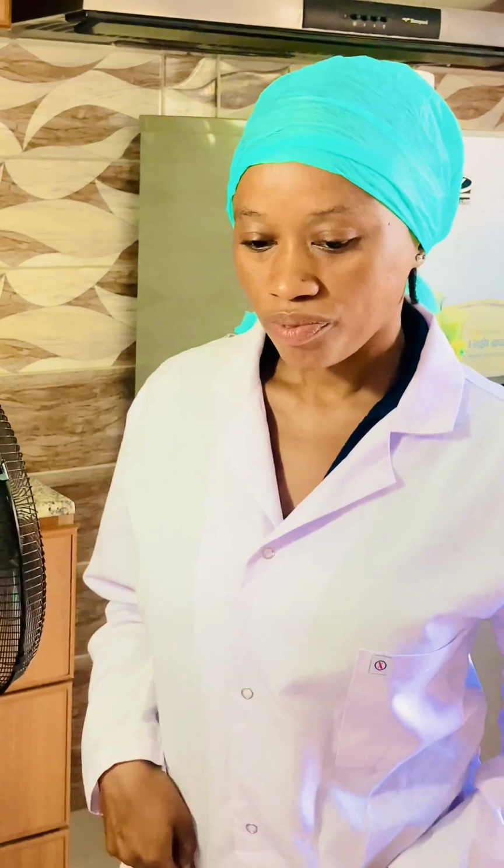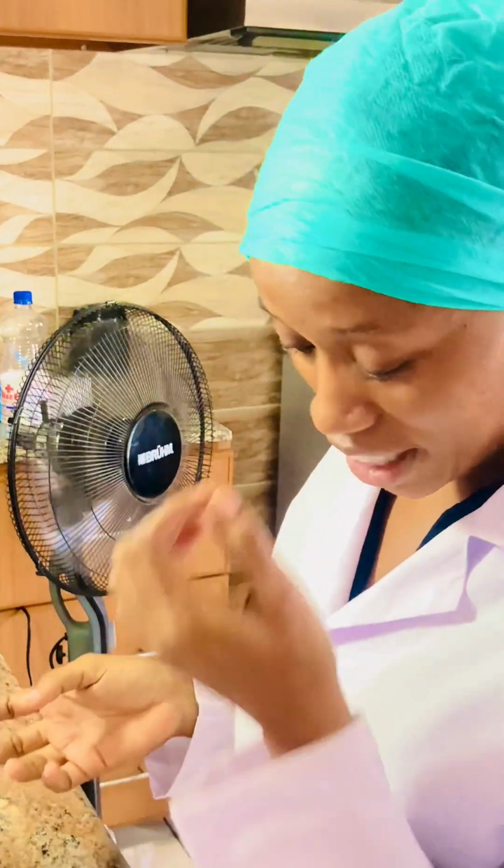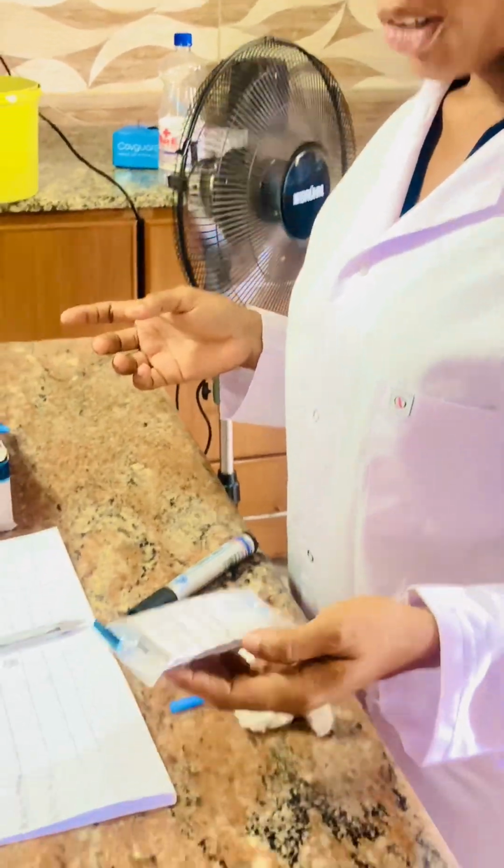Today our topic is how to do a malaria rapid test, normally called RDT. Today I will be explaining about malaria and doing some practicals on how to go about doing the malaria rapid test. Before going further, what is malaria? Malaria is a disease caused by a parasite transferred from one person to another by an infected Anopheles mosquito. And I'll be doing the practical today and showing how to go about it.